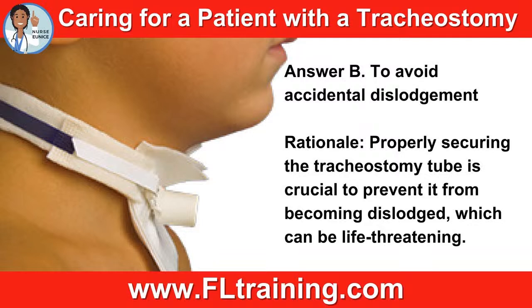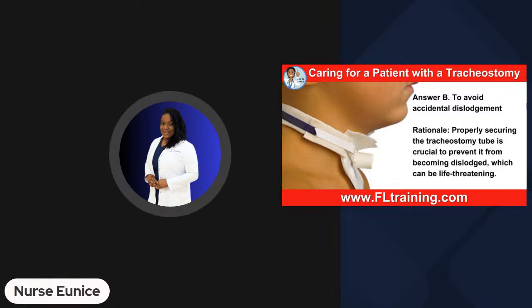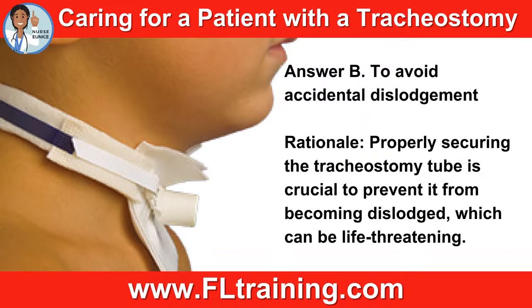So actually, third thing. First, you're going to look at your patient's face. Talk to your patient, even if they can't communicate with you verbally. They can do thumbs up, they can do thumbs down, they can nod their head appropriately. Then after that, you're going to be looking at that trach site to make sure it's midline, to make sure you're not hearing any strange sounds.